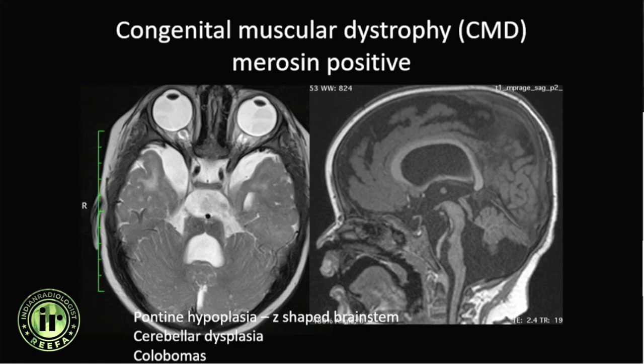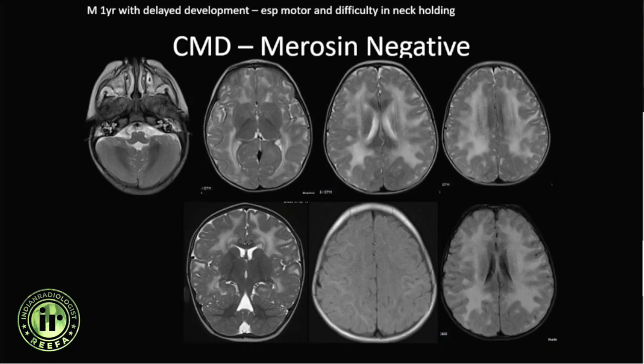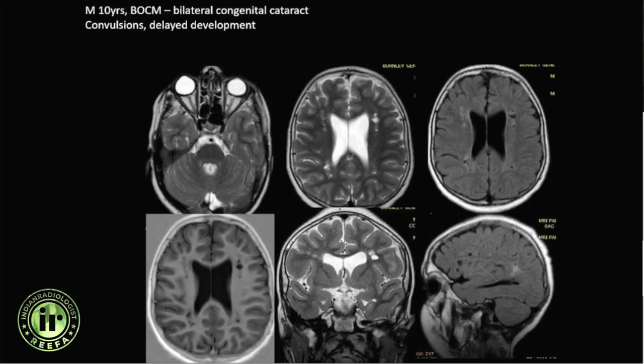Another patient — a one-year-old with predominantly motor delayed development — showed significant bilaterally symmetric white matter signal abnormalities. This was merosin-negative congenital muscular dystrophy. In this case the brainstem is normal and there are no cerebellar cysts, distinguishing it from the merosin-positive type.